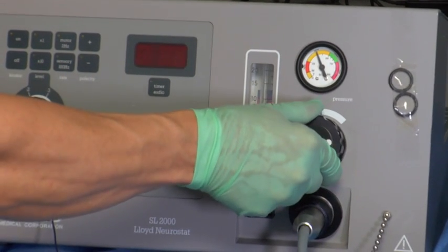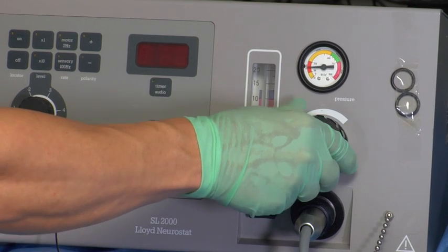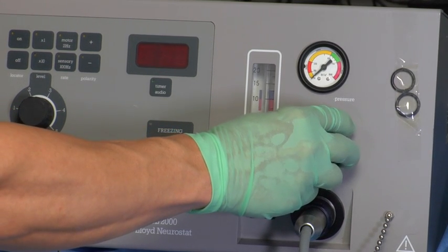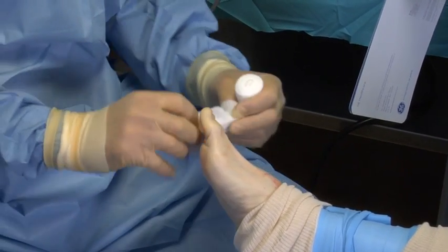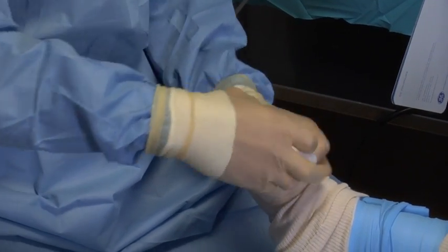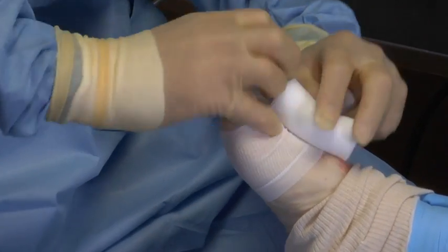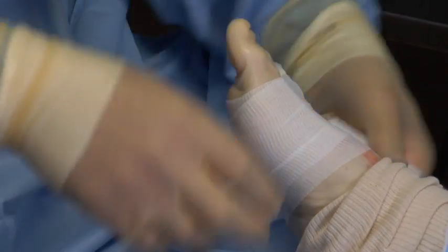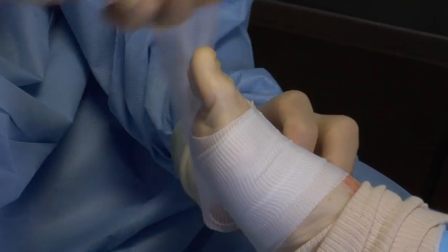So now we're able to power down the machine, turn down the pressure of the gas, and the procedure comes to an end. The patient has had 2 or 3 freezes and thaws, and it is interesting to note that it is the thaw that actually causes the lesion on the nerve that creates the decrease in the amount of pain and temperature that is felt after the procedure.